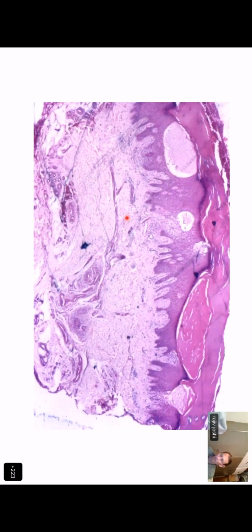So these are my DDs, sir. Very good. So what we'll do is we'll just turn your DDs upside down and start with the spongiotic first, because this is spongiotic dermatitis. Now, why is it not the first few that you said? First of all, let's look at it.